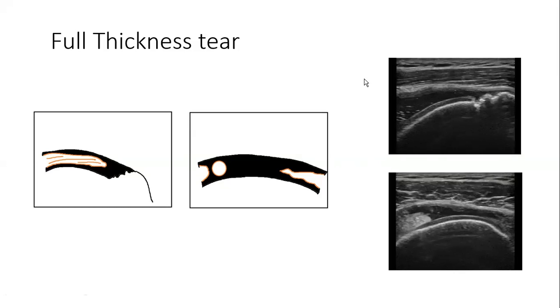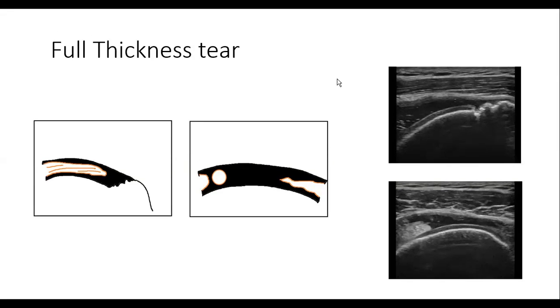So if you look at this, that's a round part of the bone, right? So that's the humeral head. This is GT. Sign, capsule or? No, that's a cartilage. Cartilage. But if you see, cartilage is showing a rim here, a hyperechoic bright rim. Okay, so I think somebody raised the hand here.